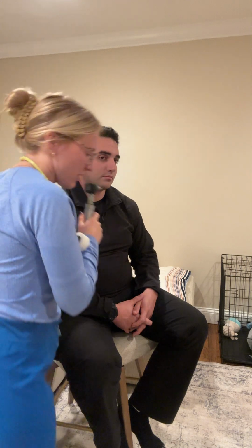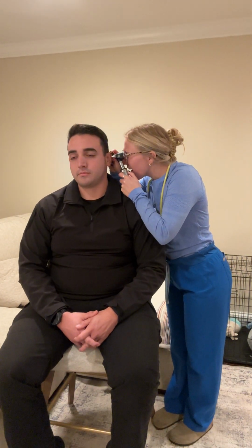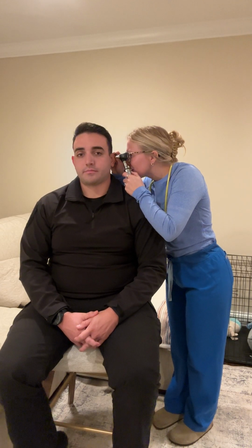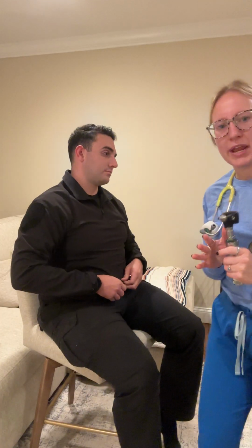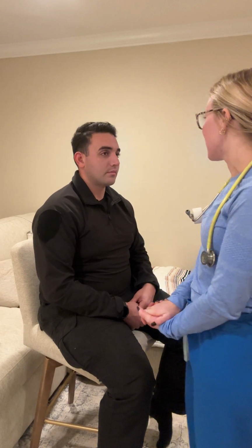Do you feel any pain at all when I pull back on your ear? I do not. Okay. All right. So from my view, I note that the tympanic membrane is intact. I don't see any lesions or cysts. I also note that it is pearly, white, and translucent in color, which is a normal finding. I also did visualize the cone of light, which is what we would like to see in a normal ear exam, so that is good.